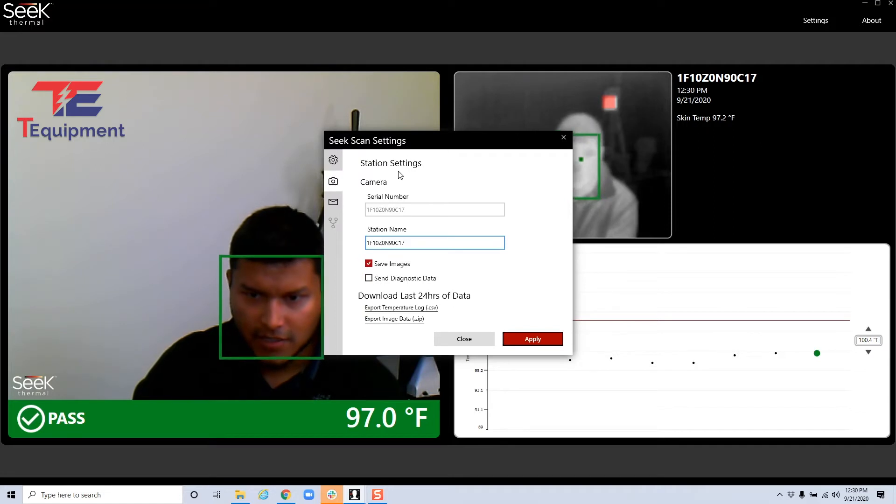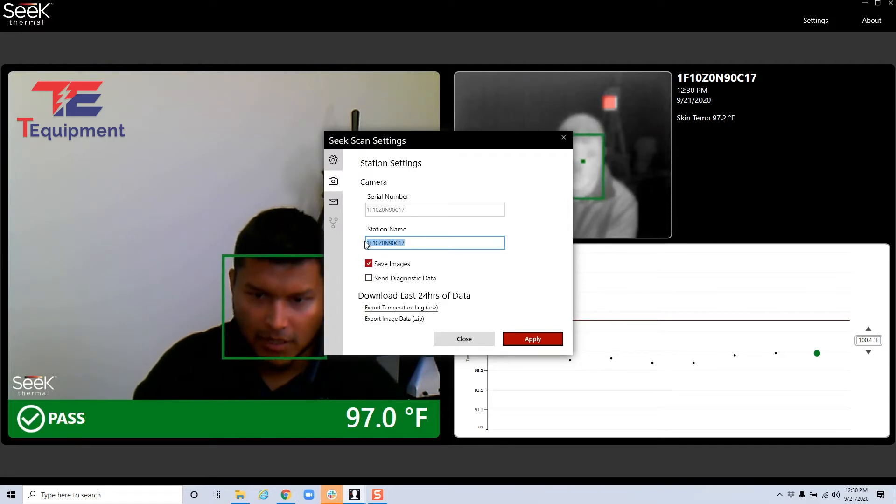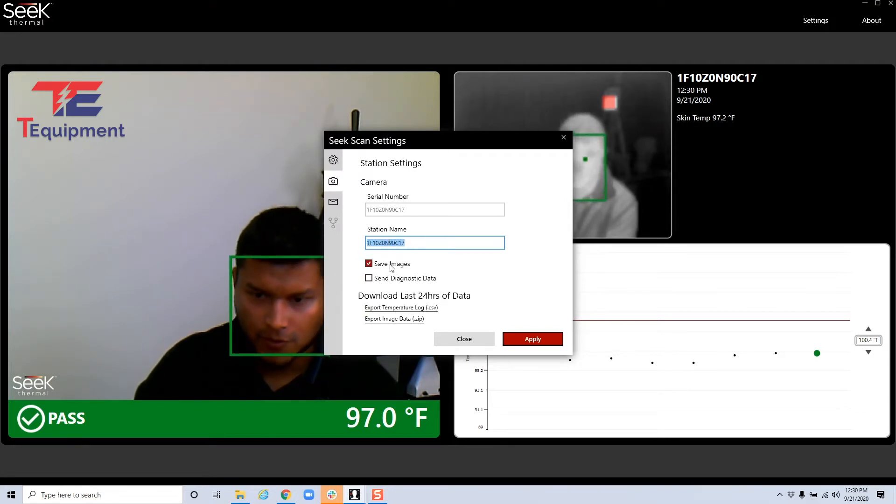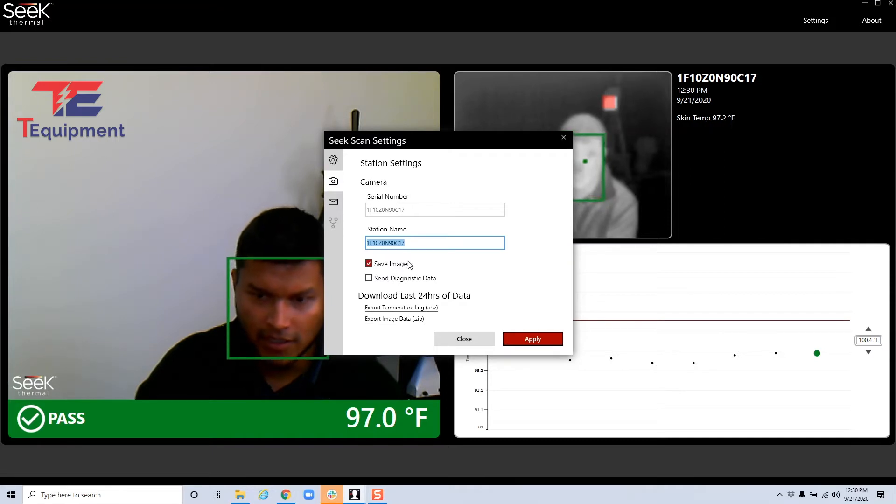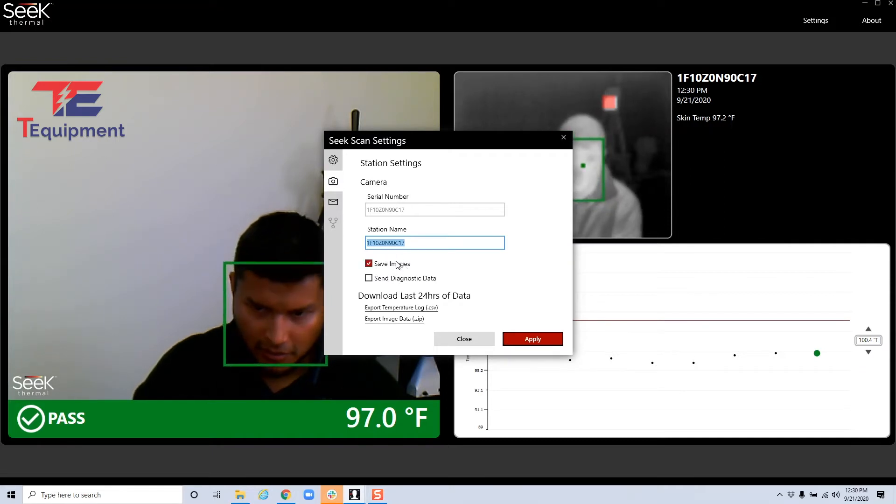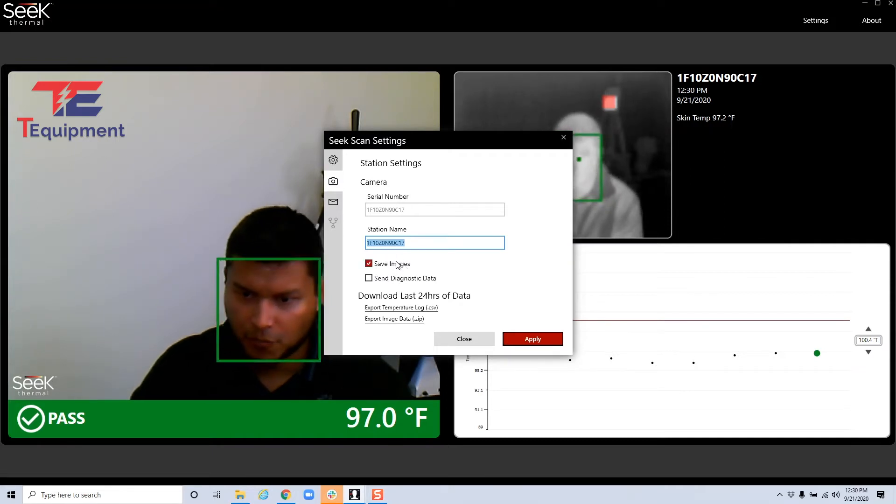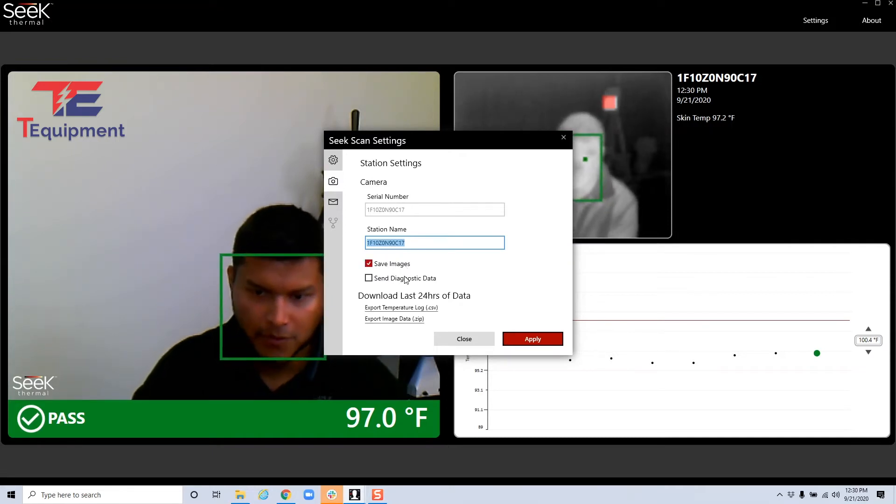As far as the station settings go, the camera, you can give it a name. Then you also have the save images functionality. This is back on the previous version, we didn't have that and it's back here again.